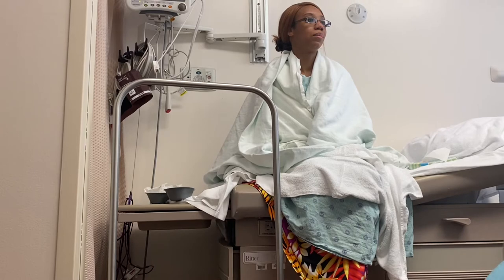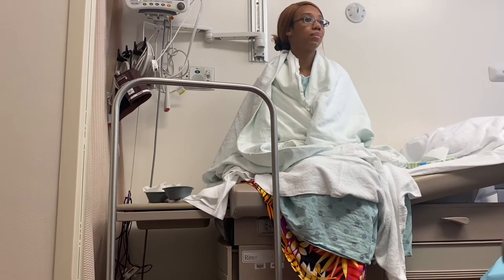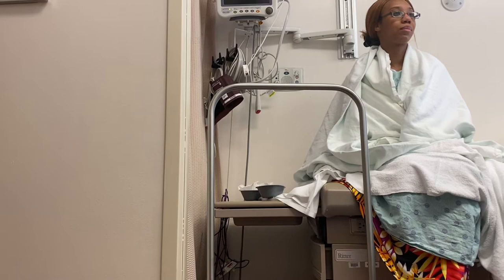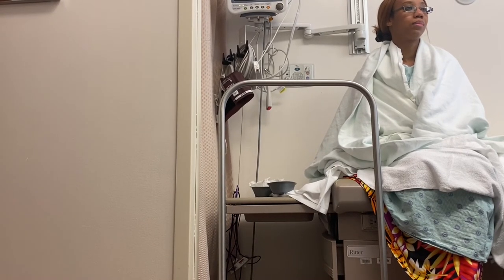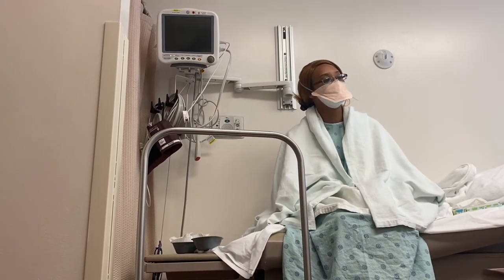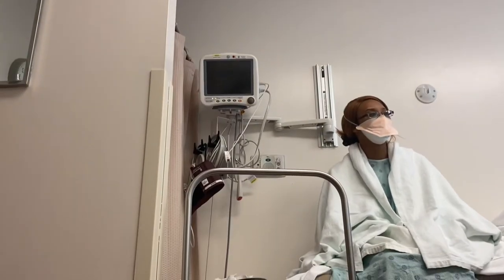It's based on their assessment of what they want to do. Sometimes they want to see if reflux is occurring, because there's something called non-acid reflux. So they'll have you on your medicine so it should block the acid, and then they'll see if it's a non-acid something backing up. We're trying to see how much acid is backing up into the esophagus, and also non-acid.